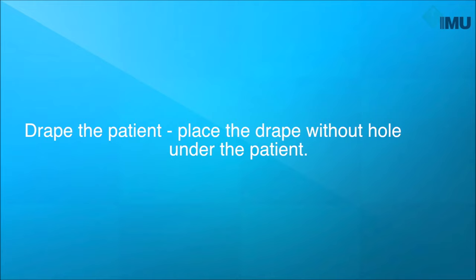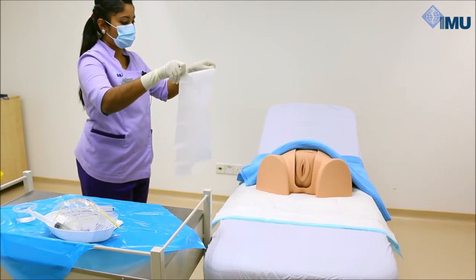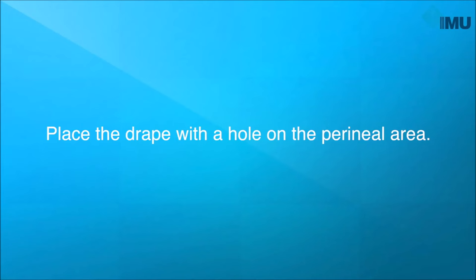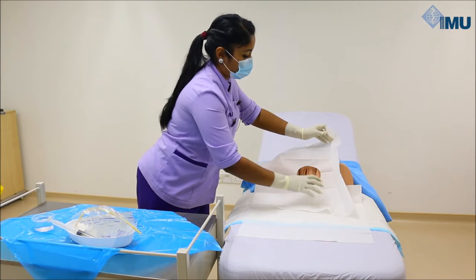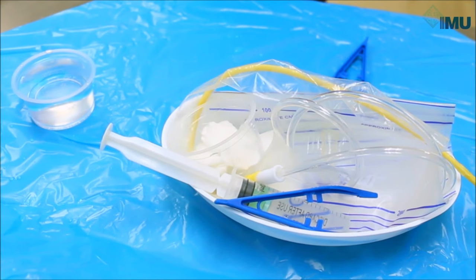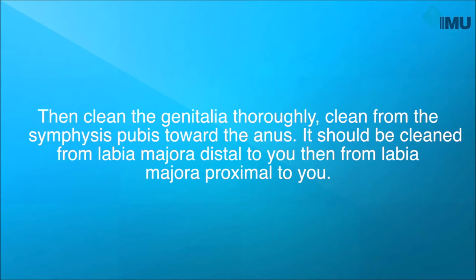Drape the patient. Place the drape without hole under the patient. Place the drape with a hole on the patient's perineal area. Place the drape in between the patient's thighs.